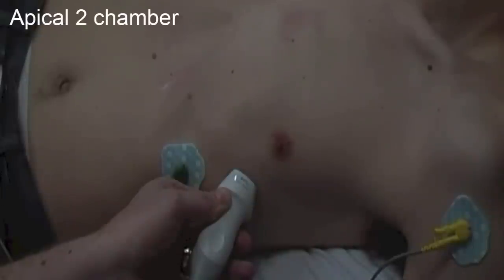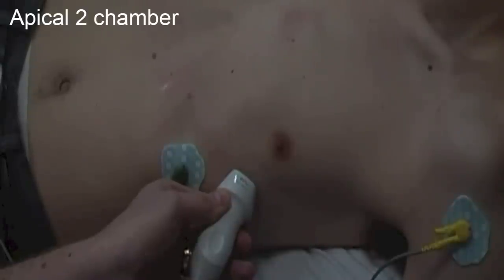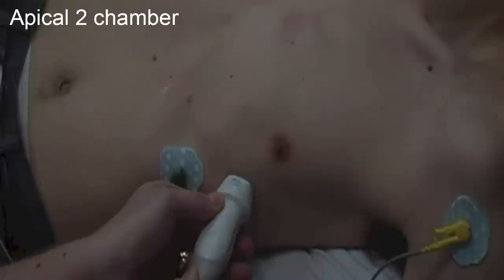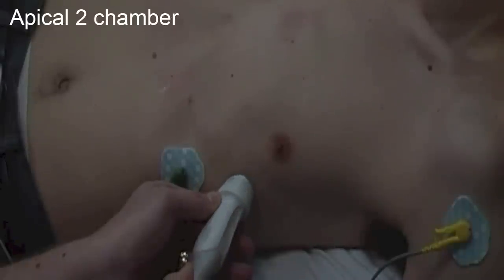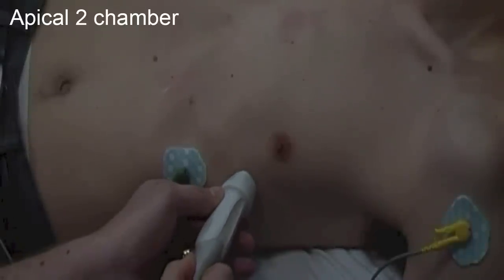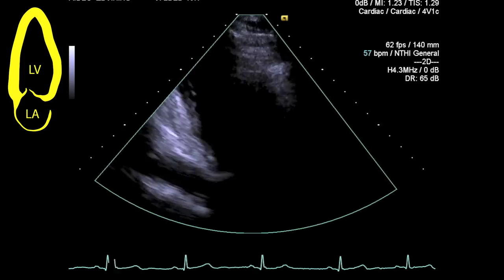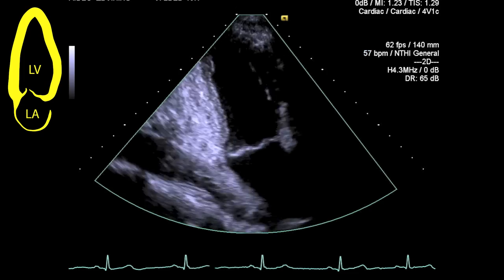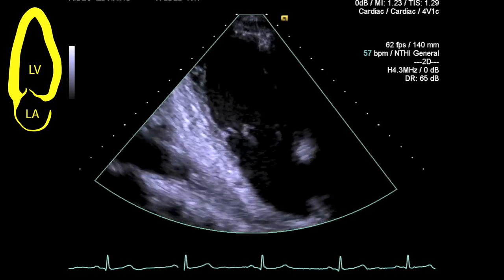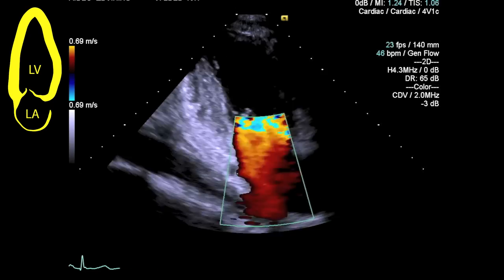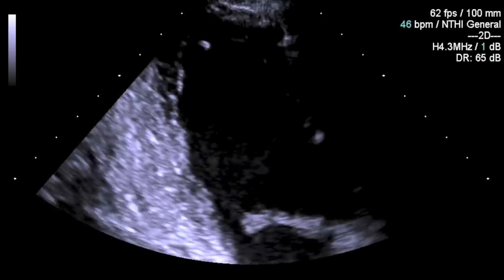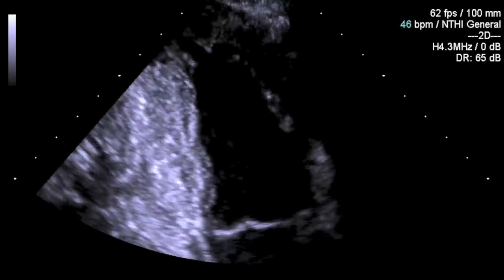The apical two chamber is achieved by rotating the probe in an anti-clockwise direction from your apical four chamber, whilst trying to maintain the same ultrasound trajectory through the apex of the heart, until you can see both the anterior and the inferior walls of the left ventricle. Make an assessment of any gross valvular pathology and have a look at the left ventricular wall contractility to see any obvious regional wall motion abnormality.